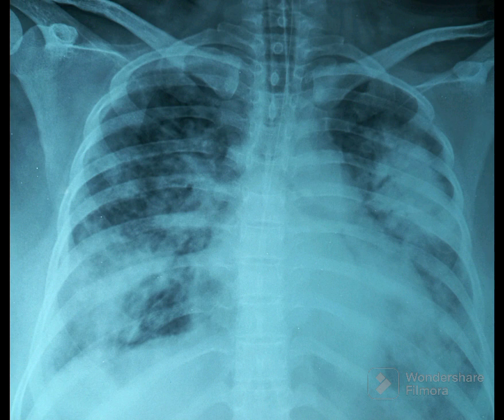Air bronchogram usually occurs in lobar consolidations, but can also occur in pulmonary edema and a few other conditions.